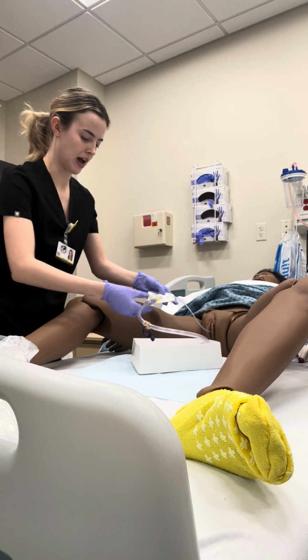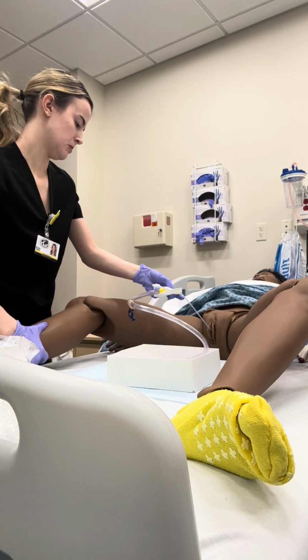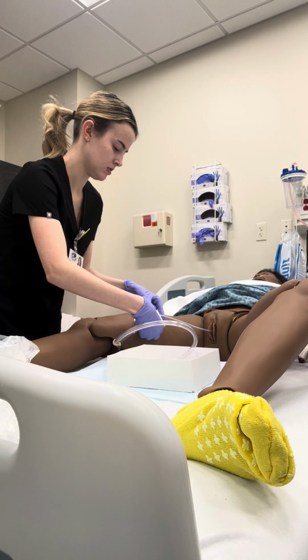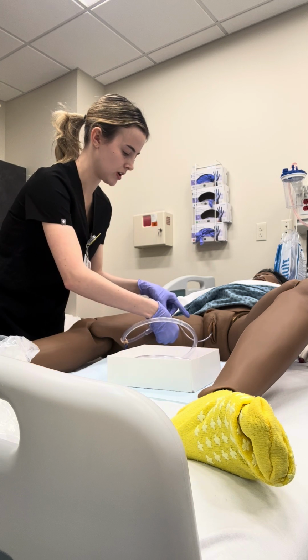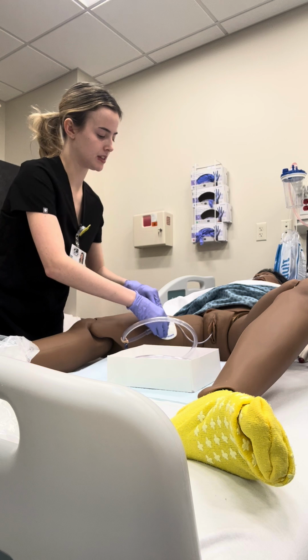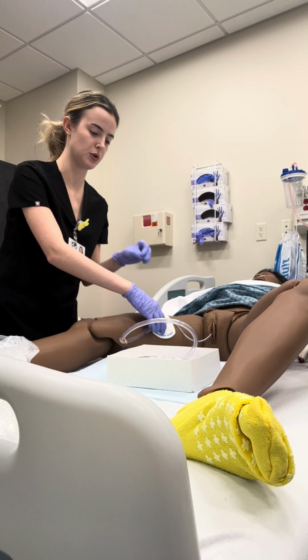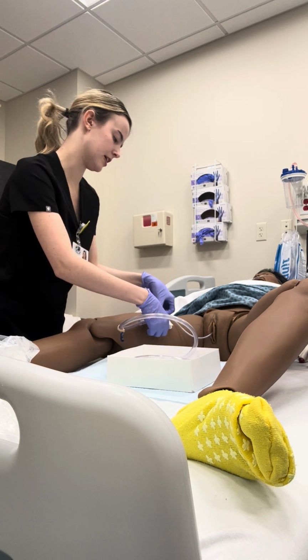And for this, I would have the patient completely extend their leg. And then I'm going to go back about 3 more inches, place it right about here, just to give them slack, because if there's no slack when they move, it's going to tug on that catheter. Place it right here on the thigh.